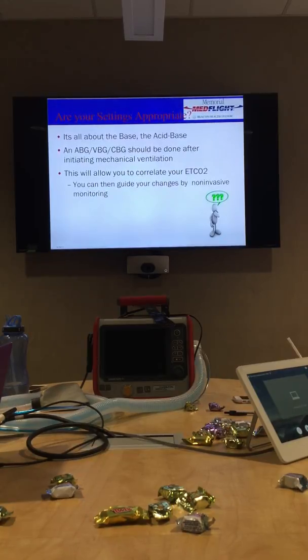All right. So that kind of gives you an idea if your patient is acidotic and, let's say, 7.2, how much do you need to change your PCO2 to achieve that 7.35?